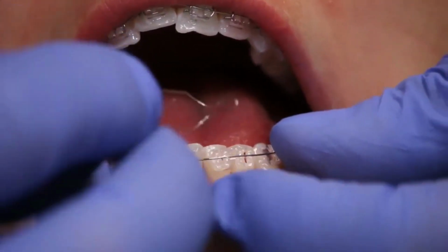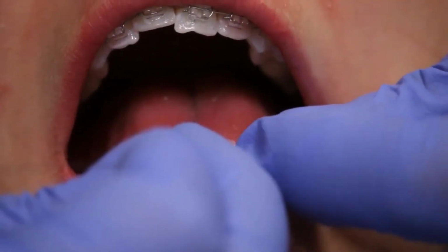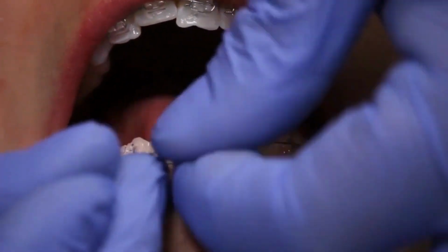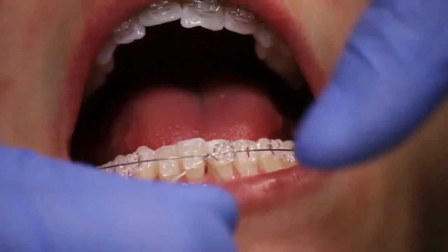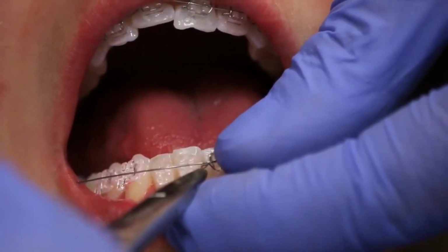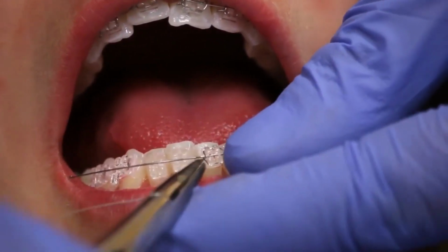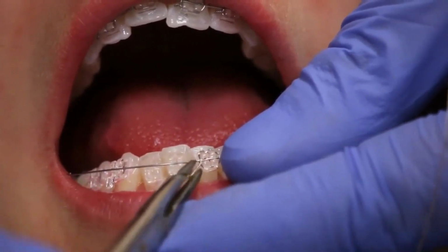But there are situations where you have patients with severe crowding. You want to secure the wire. When you have situations like that, you want to secure the wire on one of the teeth, and then you want to tie the most crowded tooth first, and then followed by the easier teeth, as you will have more wire flexibility to do that.